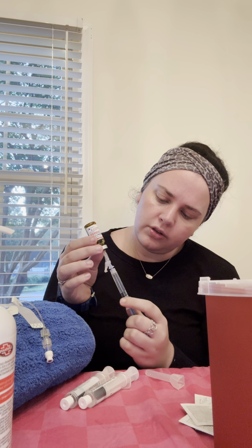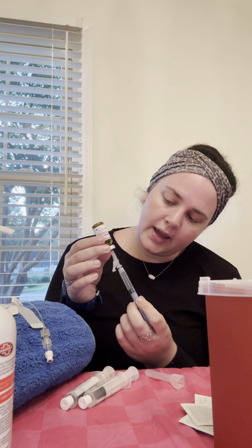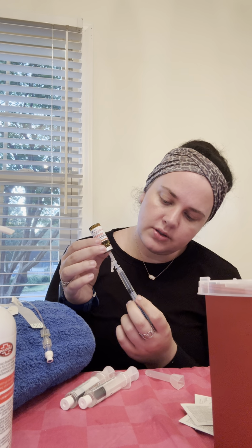So I'm just going to go a little bit past the 2, and then push it back right up to that 2, just to make sure we have the 2 ml. I'll do that. So now we have our medication that is ready.